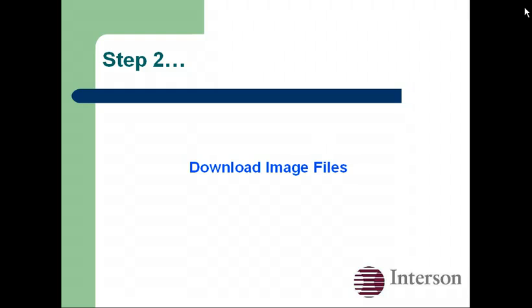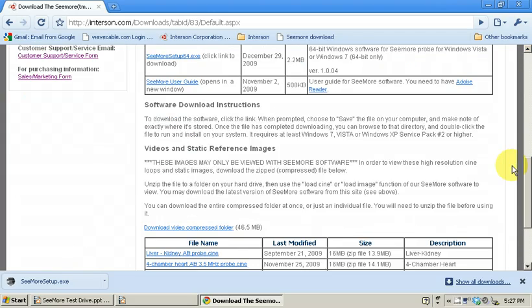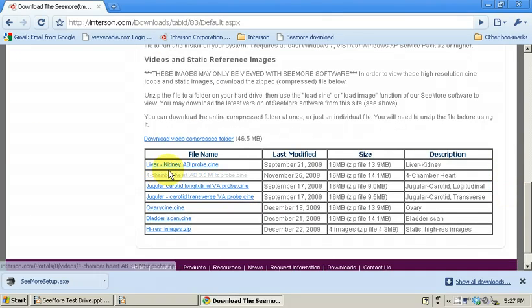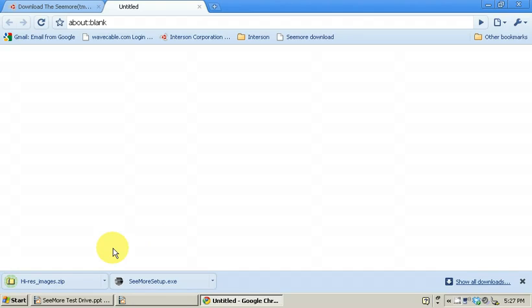Next, we'll download some high-res images from our website. You have a choice of some cine loops or some static images. In this case, we'll just download some static images. So again, on the same downloads page of the website, just scroll down to the bottom, and you'll see we've got quite a selection that we're constantly updating of different images, both cine loops and static images. And we're going to download some high-res static images in this case. And that file is a little bit larger, so it may take a minute or so depending upon the connection speed you have on your internet.